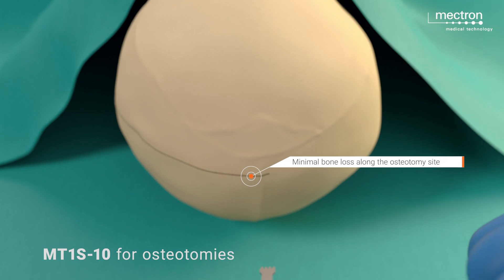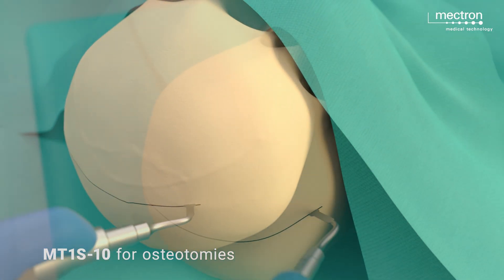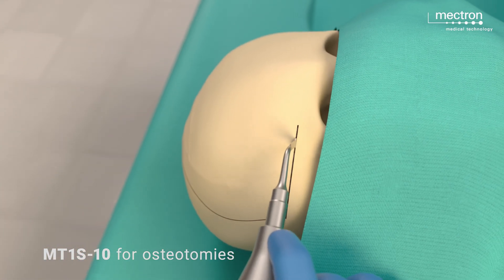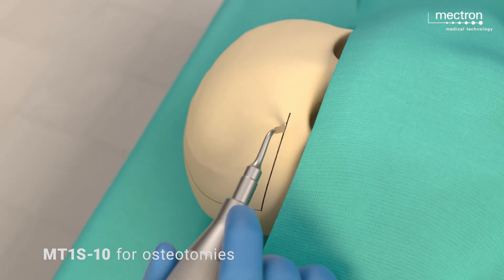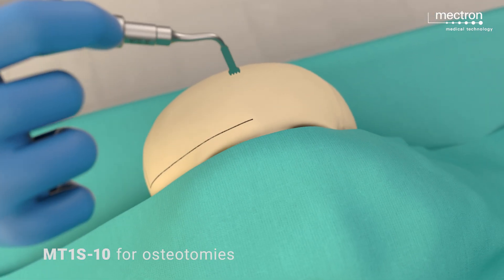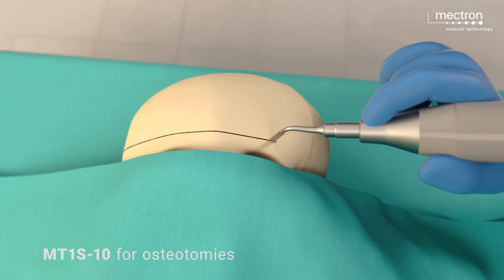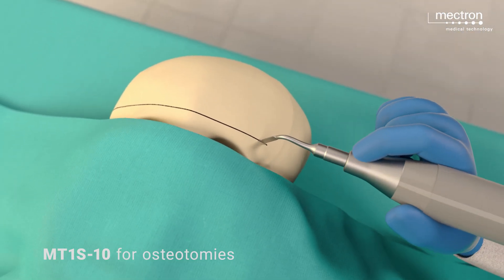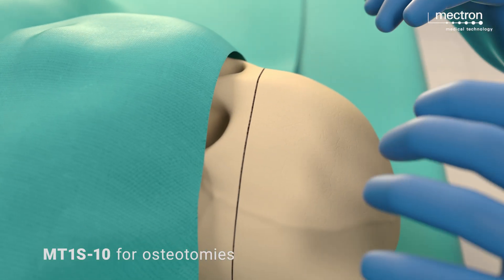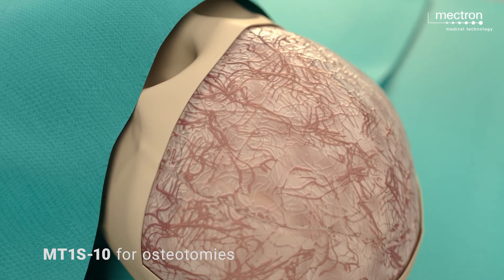Using the MT1S-10 insert, a bifrontal craniotomy is performed. The posterior border is located 2 cm behind the coronal suture, the lateral border is positioned above the two temporal sutures, and the anterior limit is 2 cm above the orbital roofs. The frontal bone is carefully separated from the dura mater through blunt dissection and is preserved.